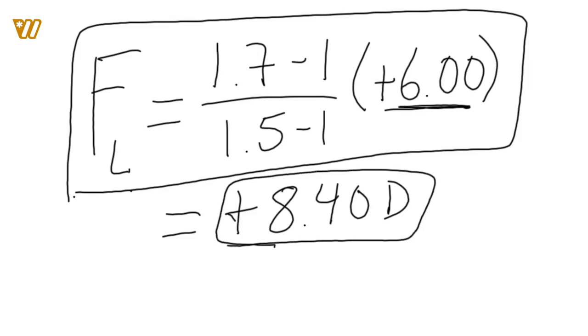So the key point on this equation is pretty simple as you're going forward. It's one of the ones you need to remember, so highlight it and put it on your equation sheets so that you can use it moving forward. Remember, the key point with the lens clock is that it measures sag, but it actually gives you a diopter value for the base curve on the readout. So whenever you've got a lens that has a different index than the index of the lens clock, you have to remember how to convert. Once you get that down, you're going to dominate these kinds of questions. Excellent. Let's keep on going.